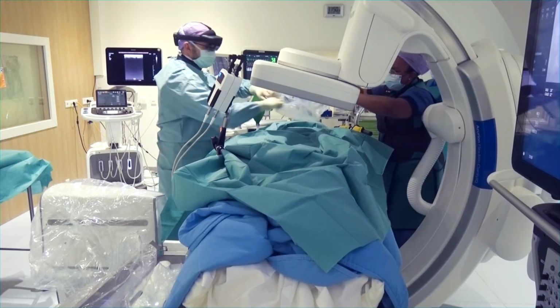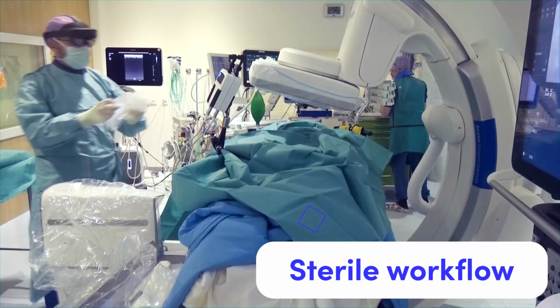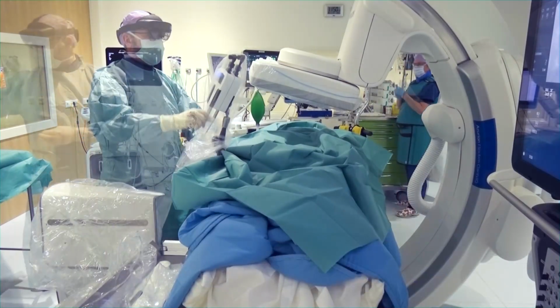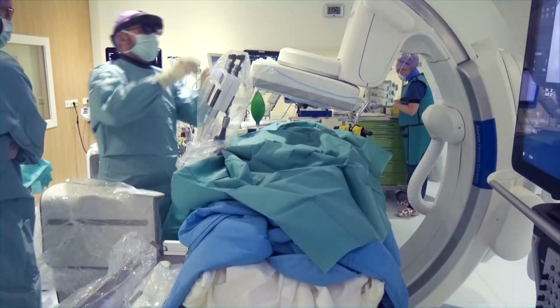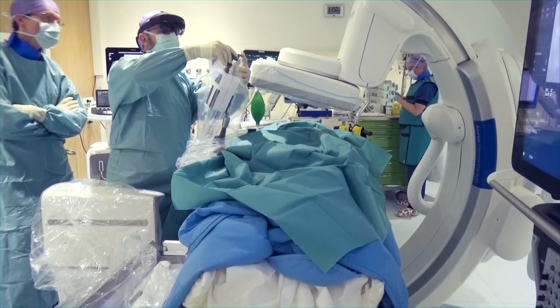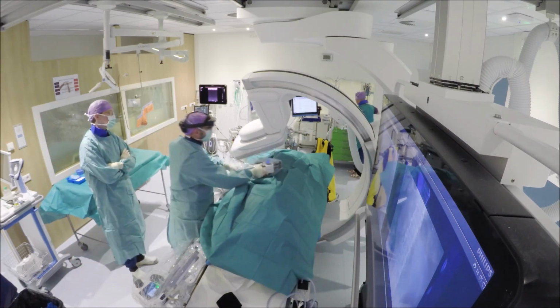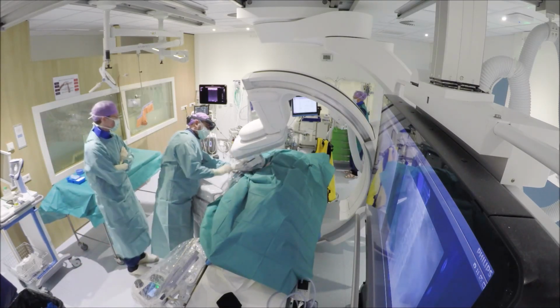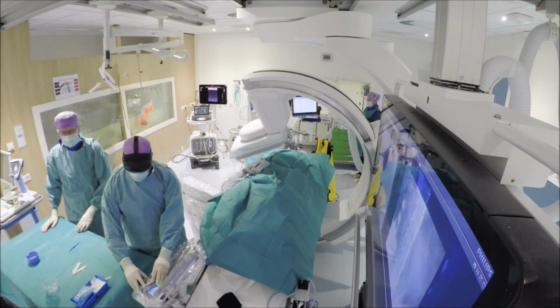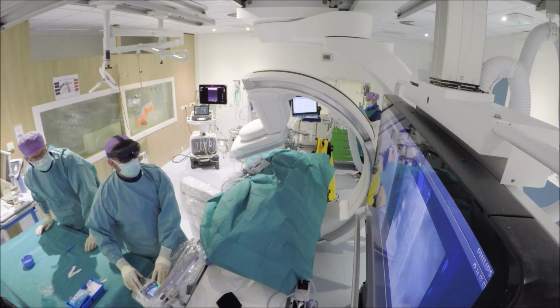In this procedure we take care not just to cover the patient, but also cover the detector and the robot so that it can be used in the same sterile environment. A small disposable piece is used as the connector between the robot and the needles. After proper positioning the robot, we set the C-arm to the first entry point position and then we steer the robot in the desired position for entering with our first needle.